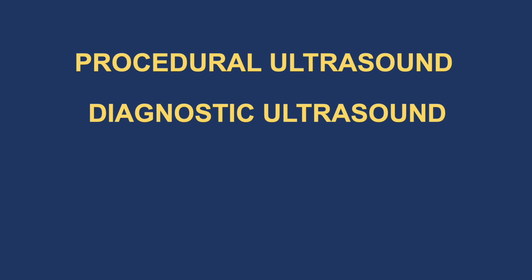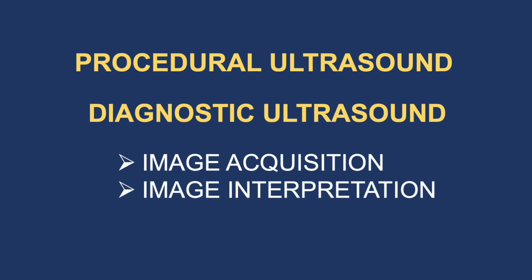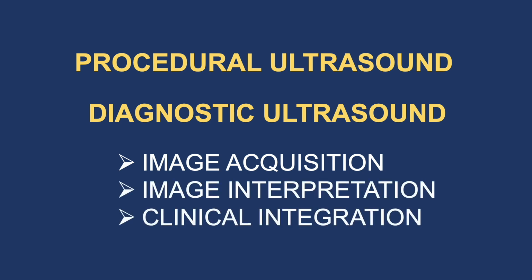Diagnostic ultrasound is becoming more popular in multiple medical disciplines because it can help the clinician arrive at an accurate diagnosis more quickly and can monitor the effects of therapy with multiple POCUS exams. We are going to focus on diagnostic ultrasound in this video. Diagnostic ultrasound has 3 components. First, you have to be able to acquire the image, and then you have to be able to interpret the image, and finally, and most importantly, you have to be able to integrate that image interpretation into the clinical picture of your patient.